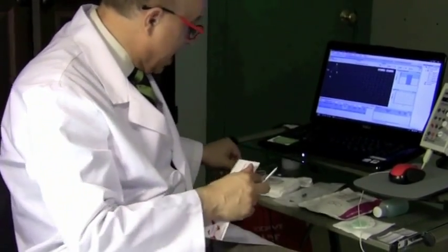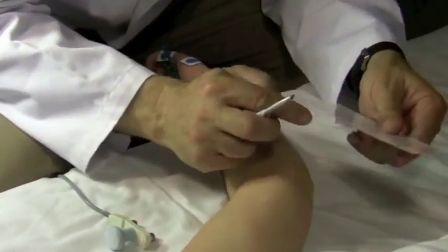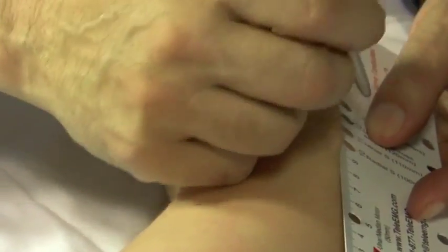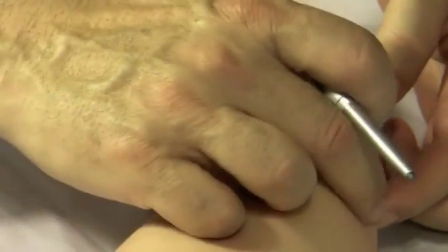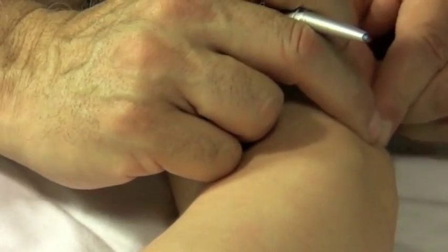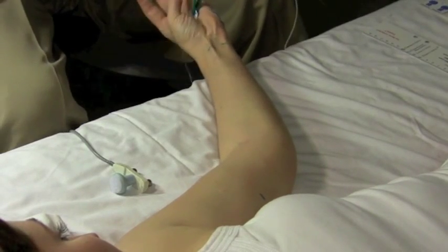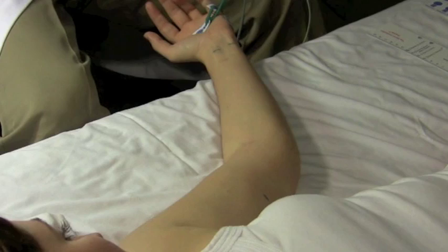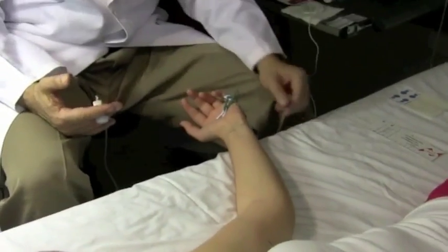So here we go. What I like to do is measure the nerve 2 centimeters below the elbow. So I put it at the elbow groove right here, and I mark the 2 centimeter point, and 10 centimeters above. So this is 10 centimeters above the elbow, this is 2 centimeters below, so from here to here is 12. Again, I have normal values for this, that's why I use that. And like I said before, the response from the wrist, above and below the elbow in normal subjects has to be quite similar, otherwise there's a problem.